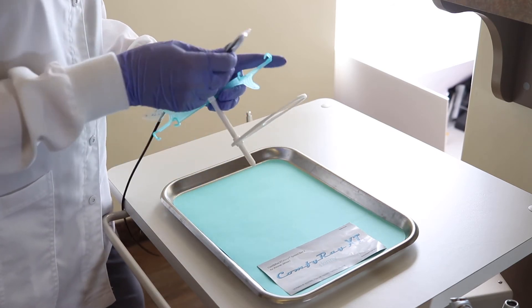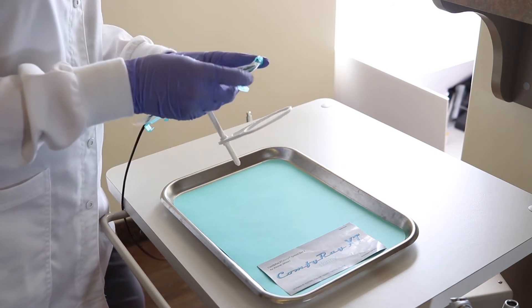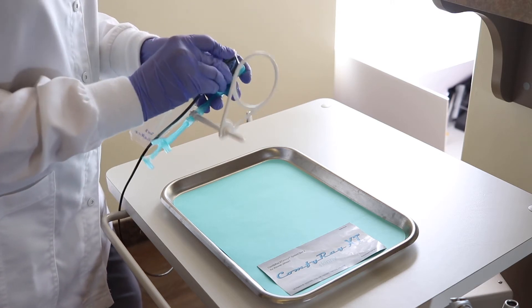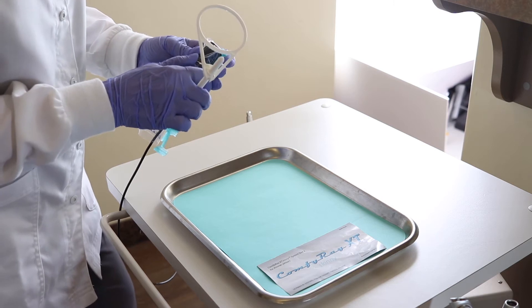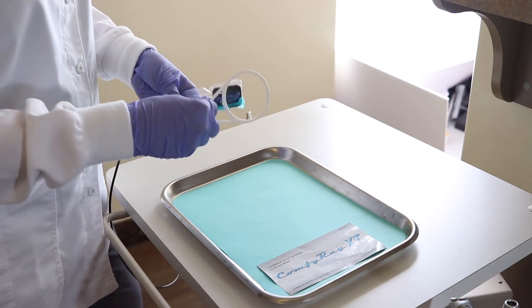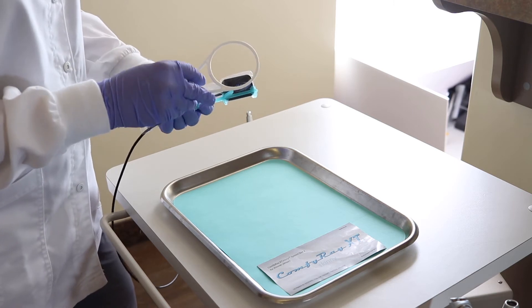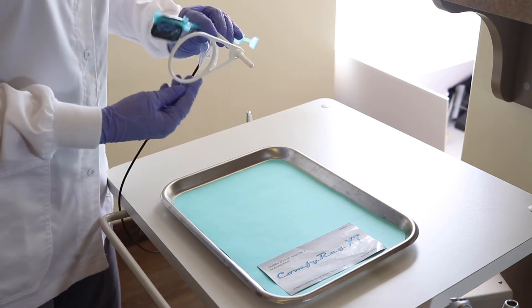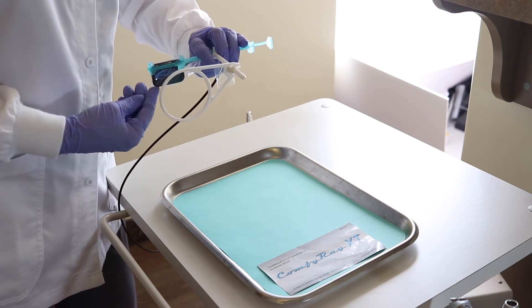With these sensors, you can either slide them in or you can snap them in. Today, we're going to be sliding this in. As you can see, I positioned it in the high position and my ring is in the high position. So again, you would take two upper posteriors, then flip it over and take two lower posteriors.